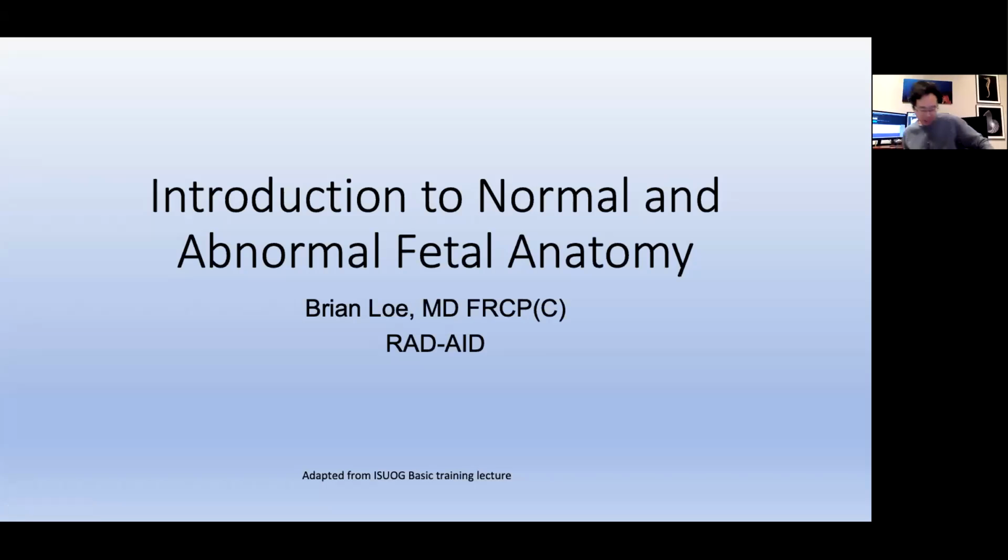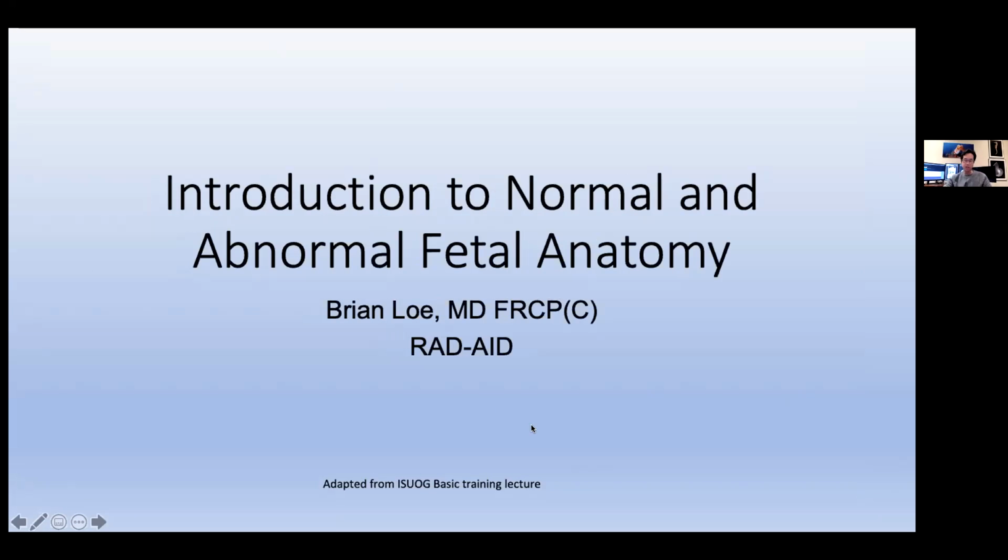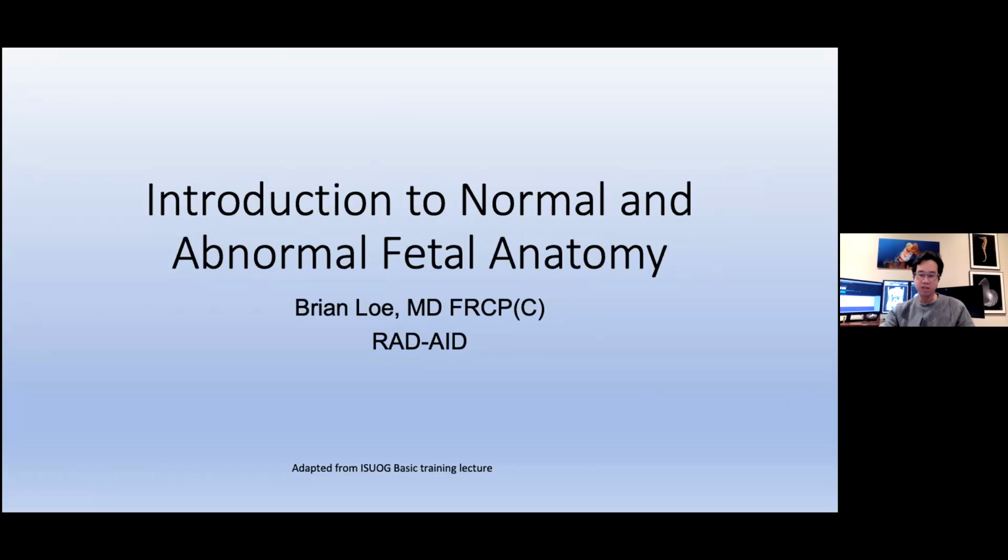We'll get started. I was going to give a lecture on anatomy in the obstetrical ultrasound. This is a lecture that I've adapted from the ISUOG basic ultrasound lecture that is available on their website.